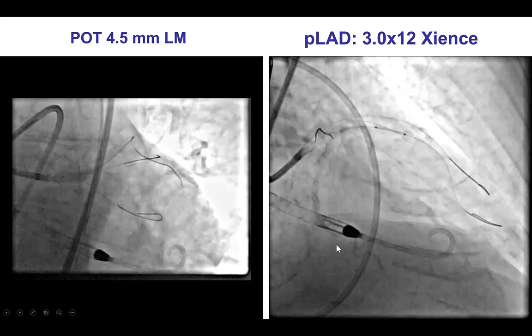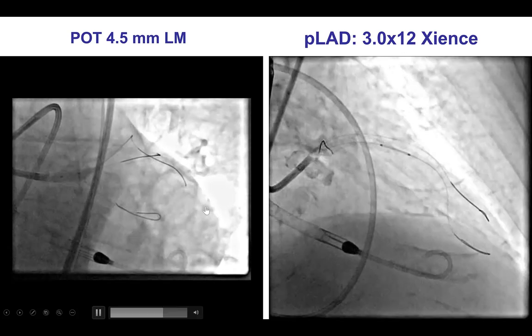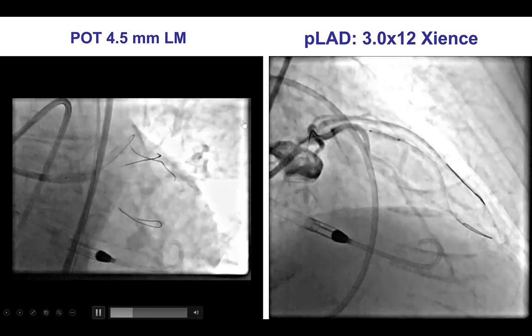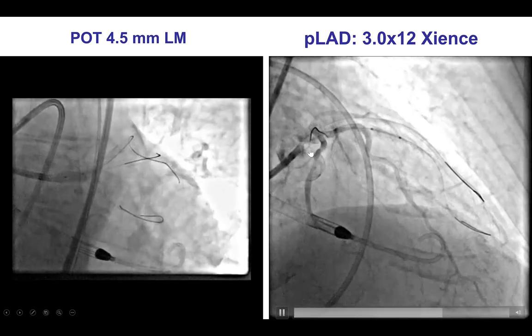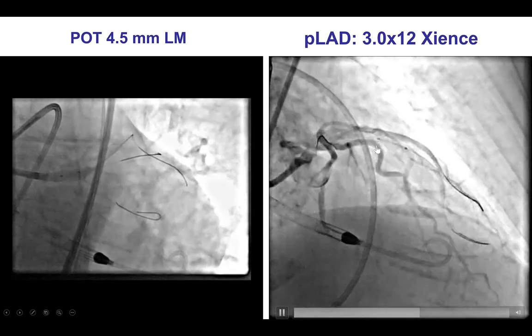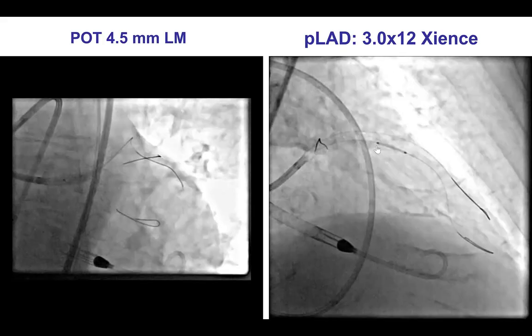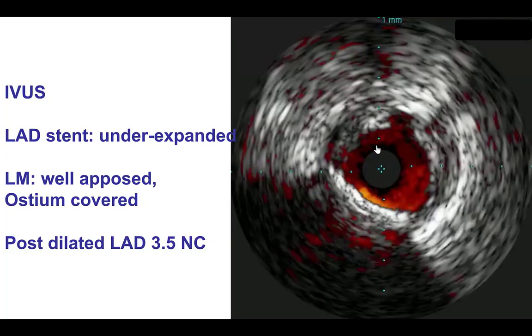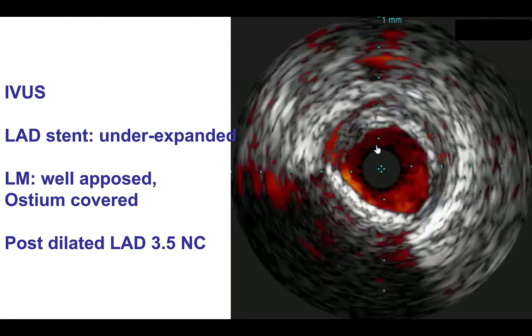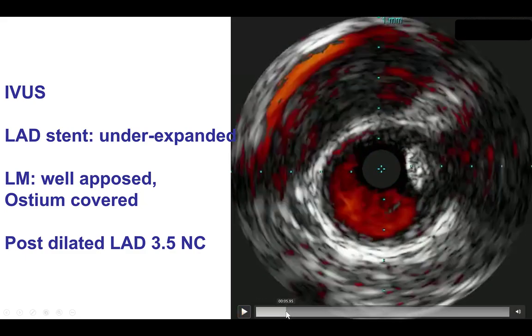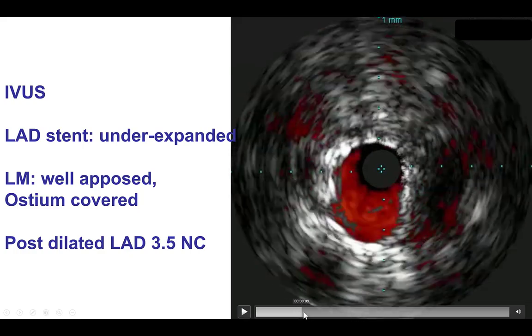The stent was placed. We then did the proximal optimization technique with a 4.5 mm balloon in the left main, and then stented a lesion more distal in the LAD with a 3.0 mm drug-eluting stent. With the intravascular ultrasound — again, given the calcification, ostial disease, and left main disease — imaging is critical.